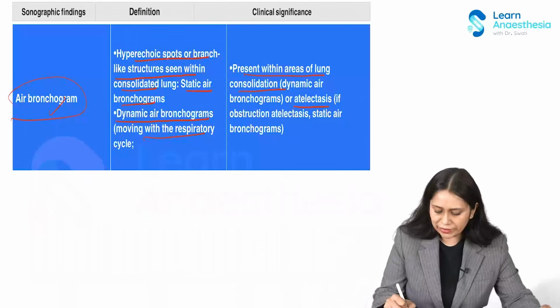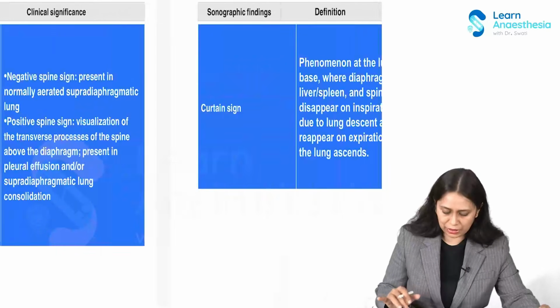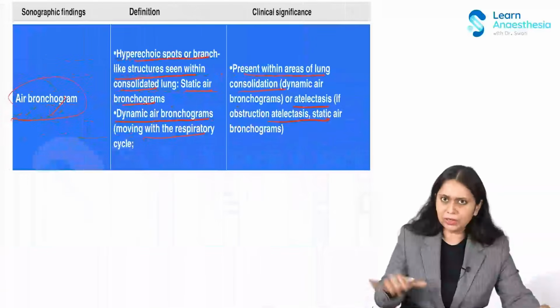In atelectasis, we get the obstructive or static air bronchogram. I'll show you the image as well. Okay, so let's first finish the discussion, then I'll show you the image.